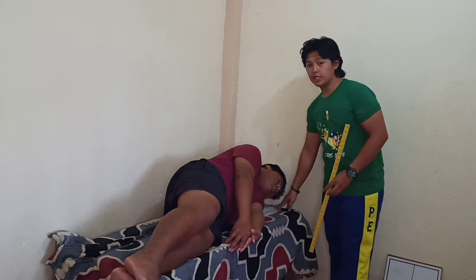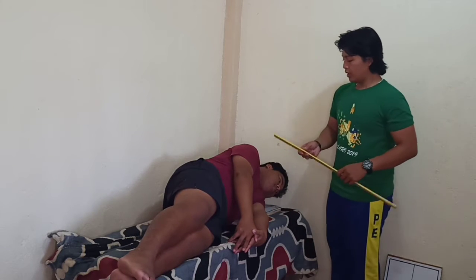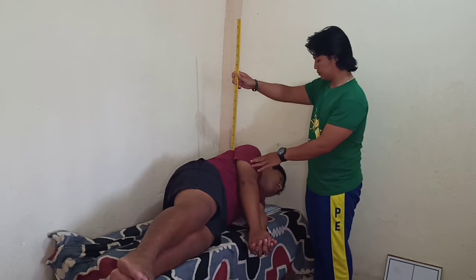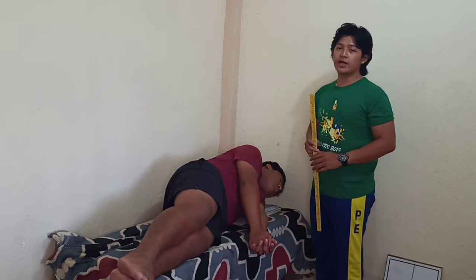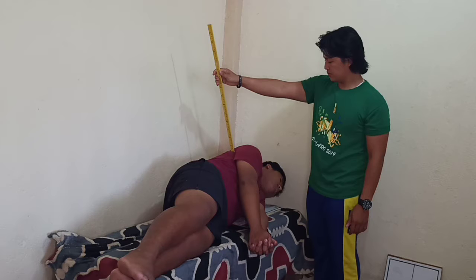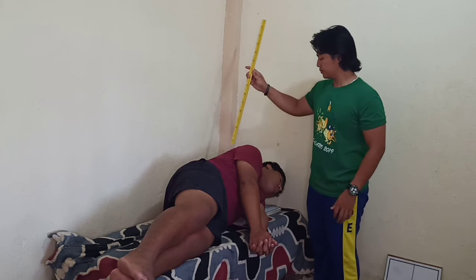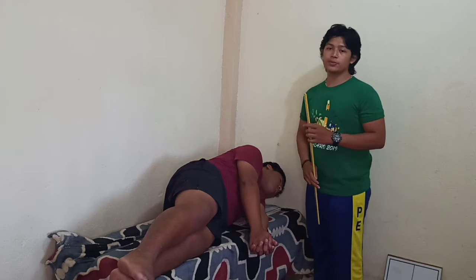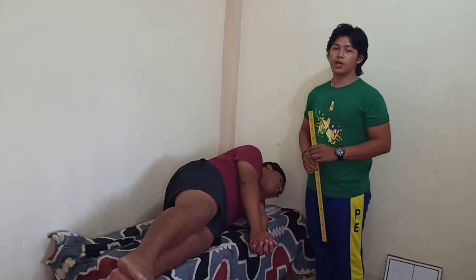And use 14x17 image receptor and center the image receptor at the level of the T7. And the central ray must be perpendicularly directed at the level of T7. For male, 15 degrees cephalad at the level of T7. For female, 10 degrees cephalad at the level of the T7. The structure shown in this projection is the interspaces of thoracic vertebra and the intervertebral foramina.